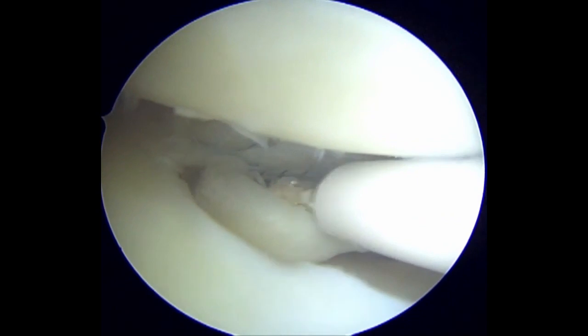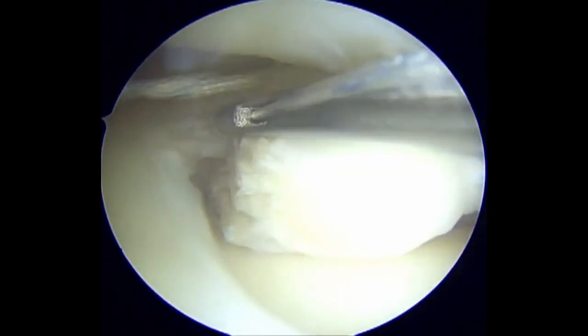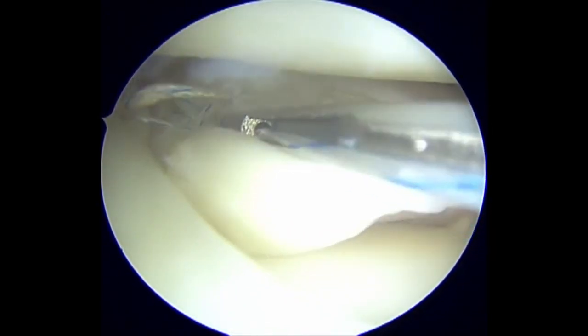A second side-to-side stitch is placed at the middle of the radial tear, in the red-white zone of the lateral meniscus. This stitch further helps to reduce the gap across the radial tear.